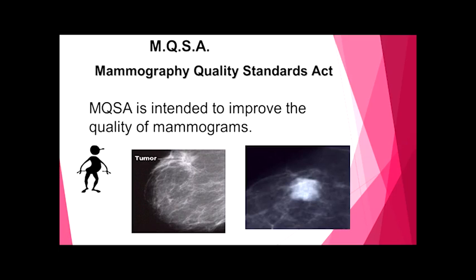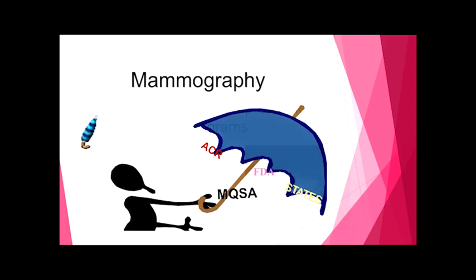It has been difficult. It's been expensive. We've been under the scrutiny not only of the federal law that regulates the performance of this procedure, but also the public. And so we're going to talk a little bit about that before we get into the technical parameters.